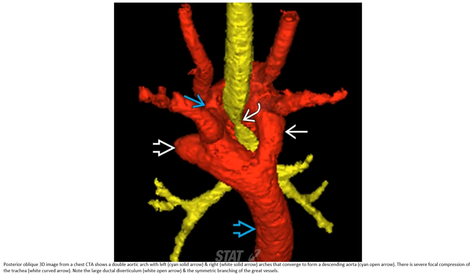A posterior CT image from a chest CTA shows the aortic arch with left and right arches converging to form the descending aorta. This demonstrates focal compression of the trachea. Note the large ductal diverticulum and the symmetric branching of the great vessels.